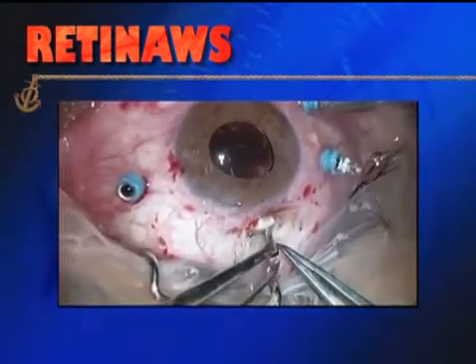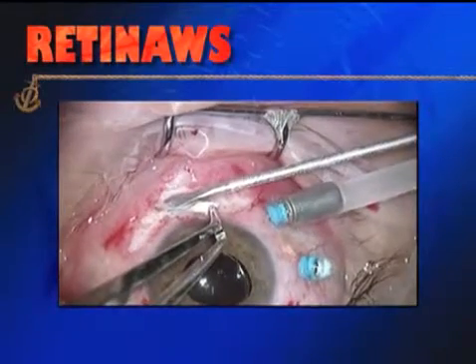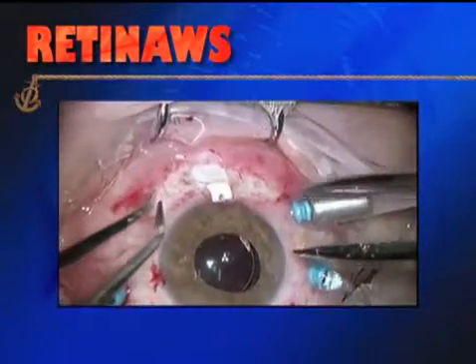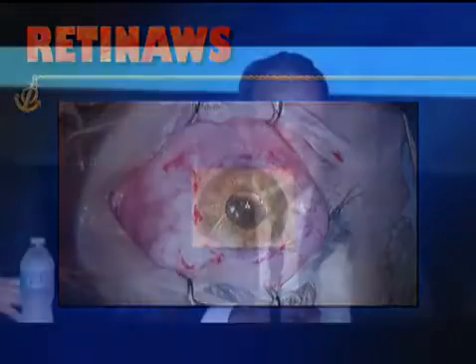And I create pockets, scleral pockets, with the MVR blade, and I embed the haptic there, avoiding suturing. I just suture the scleral flap and then the conjunctiva. And the IOL, as you can see, is well centered.